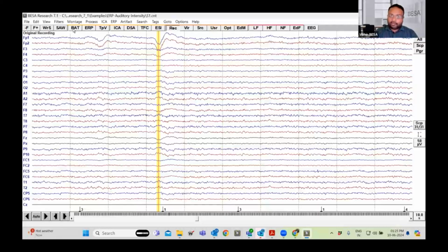We also have many different buttons, and my colleagues during their talks will explain each one of them, how they are used and why they are used and when they should be used for ease of work. But for now, I want to leave it there, and let us go to montages and see how we can make use of the montage system.